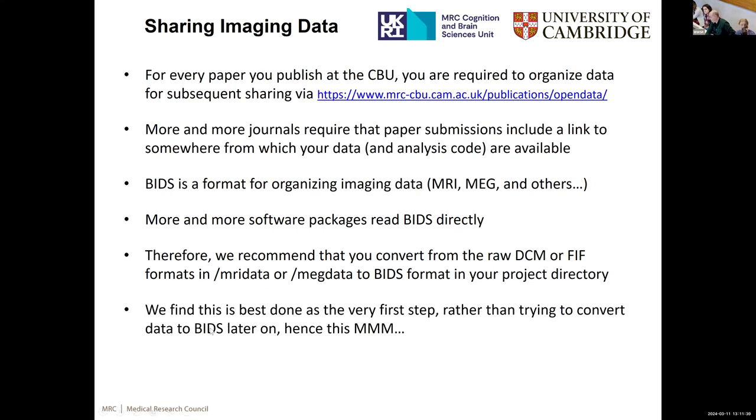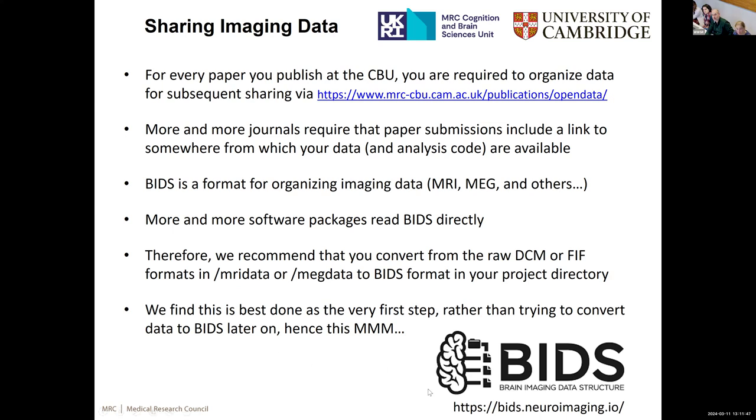Trust me, it's painful doing it later. Better to do it at the start, even though it's a little bit tedious. It is important. If you want to read more about BIDS, the complete specifications are online. You search, how do I represent this in BIDS, and there'll be information there. So that's what I wanted to say, just to explain why.